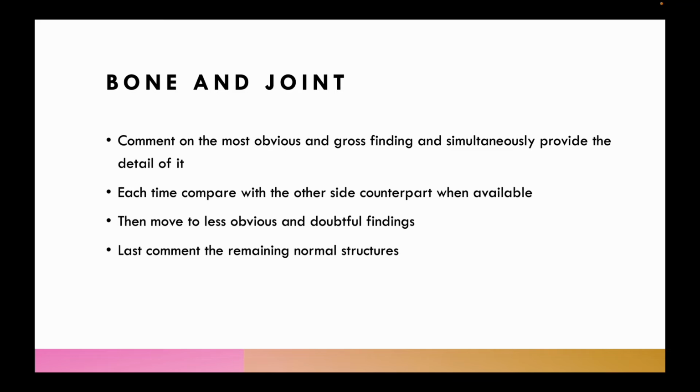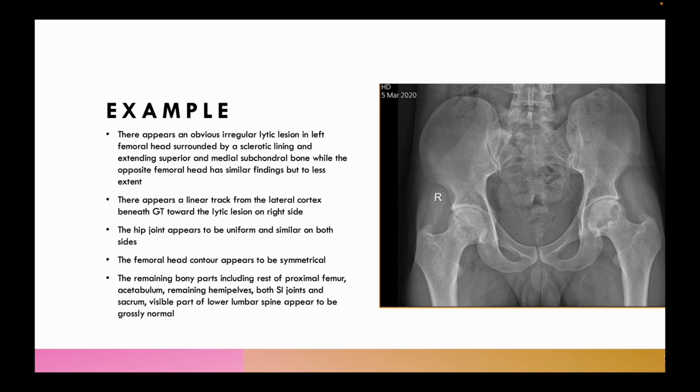Then we have to move towards the less obvious findings, and for which we are not sure, comment upon the remaining normal structures.